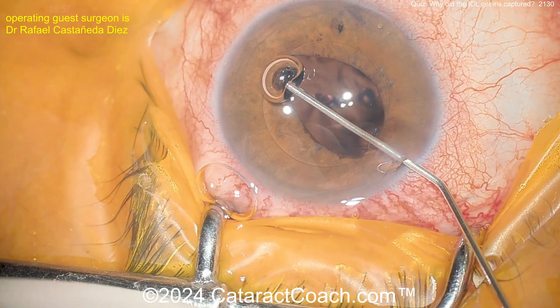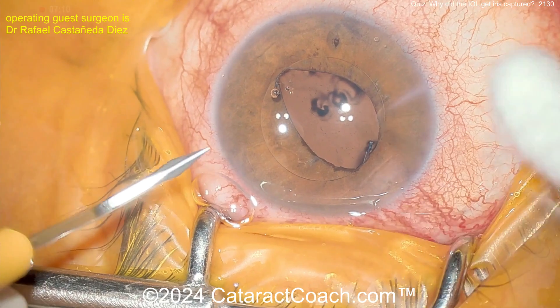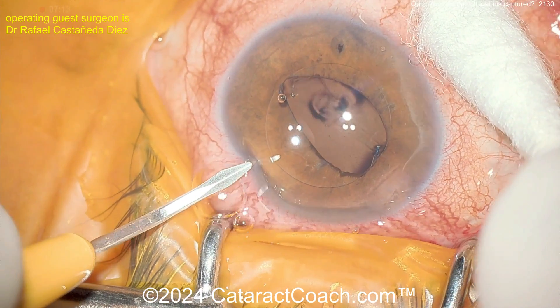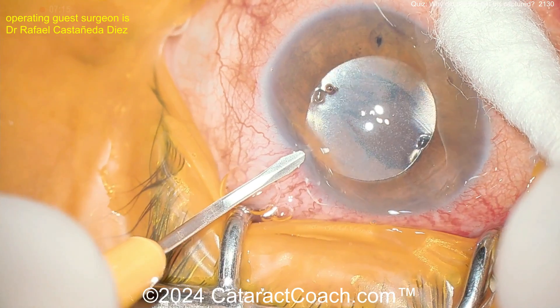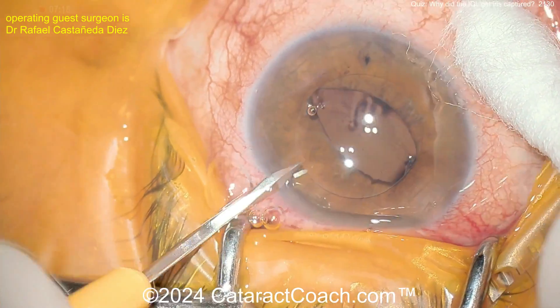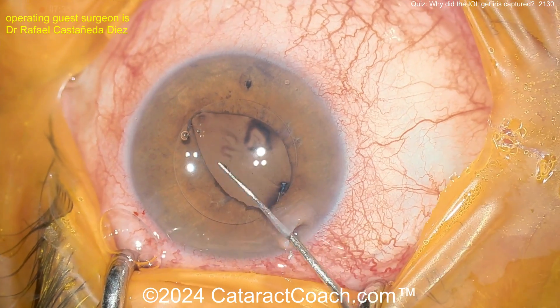Our guest surgeon needs to make sure this lens doesn't fall back into the vitreous. Let's see — get another paracentesis; it's always helpful to have a paracentesis or two to help with extra instruments in the eye. There's the paracentesis, nicely made.